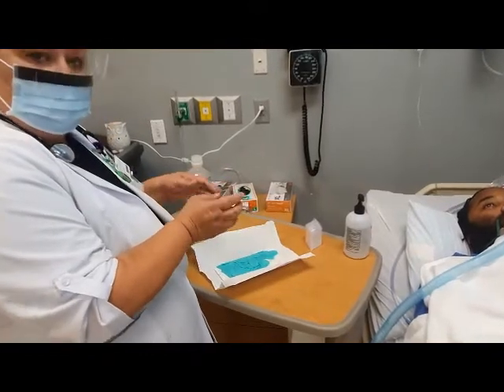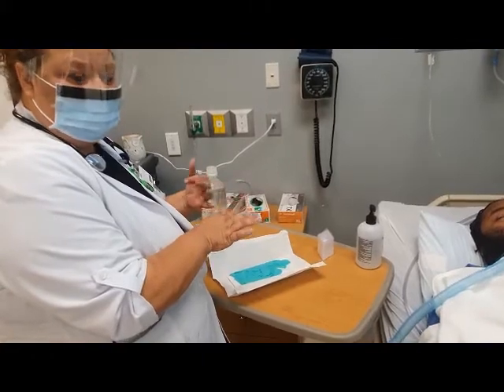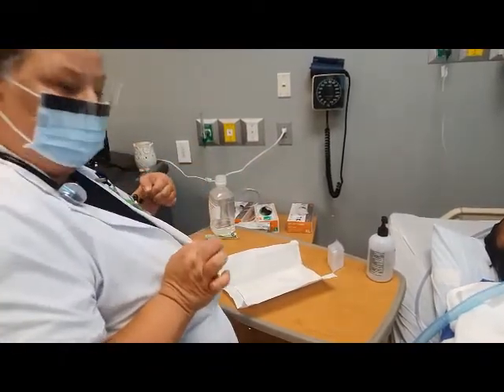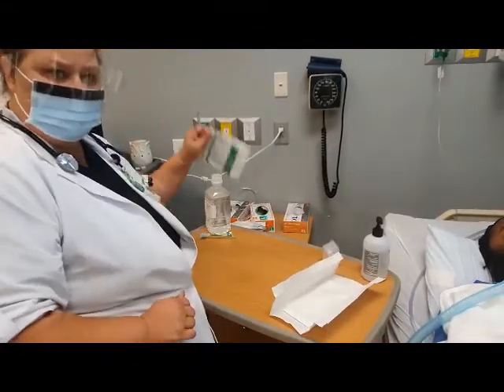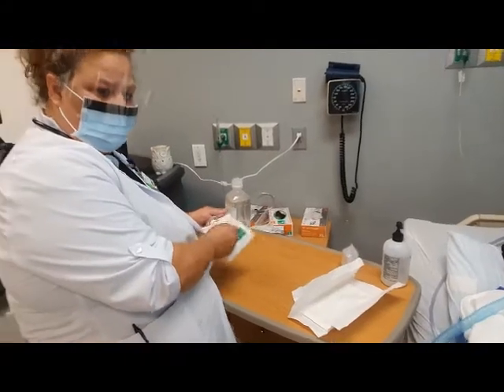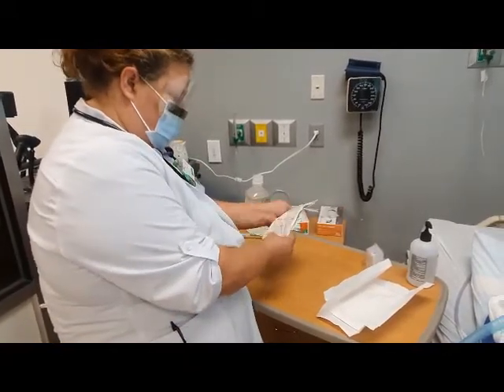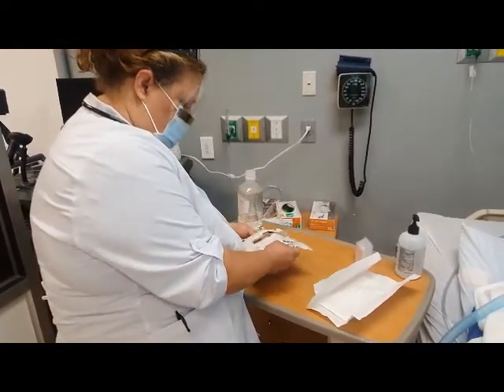Okay. At this time, you can either use the gloves that are in the kit, but the gloves are a little too small for me, so you would remove these gloves and dispose of them. I will then move this to the side right here, and I would take my sterile gloves. If you didn't have room on the table, you could open it up on the chest, but just be careful not to contaminate. Again, you see how I'm opening these and folding them.